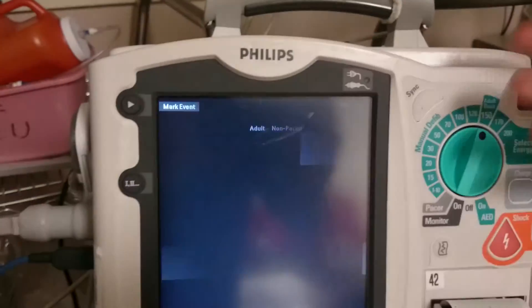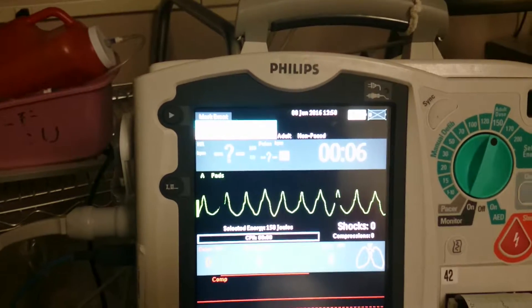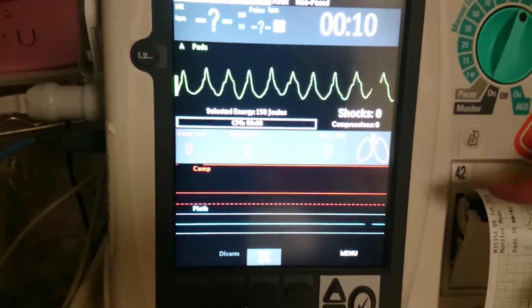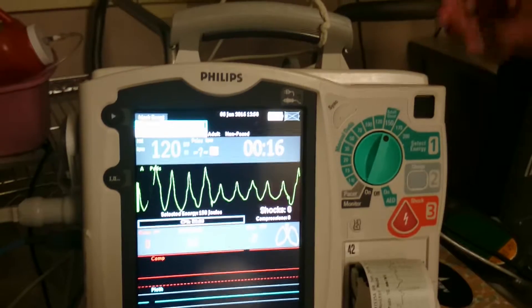You let it boot up. It'll show the rhythm — right now I have it showing VTAC. It also shows other advanced features which I'll go over in other videos. For now, since we're defibrillating, there's one thing to keep in mind.